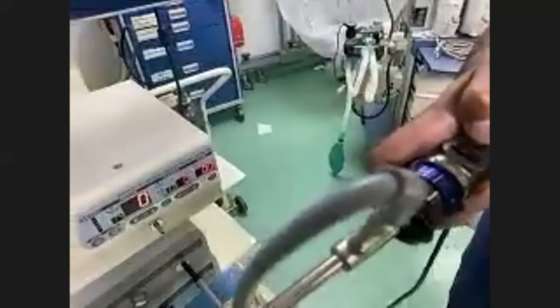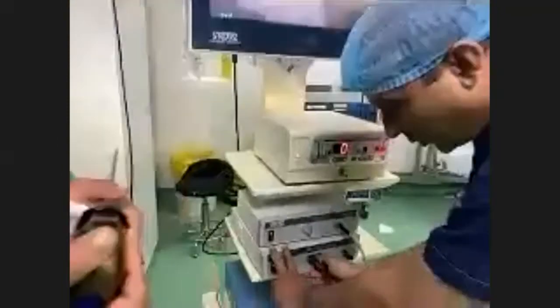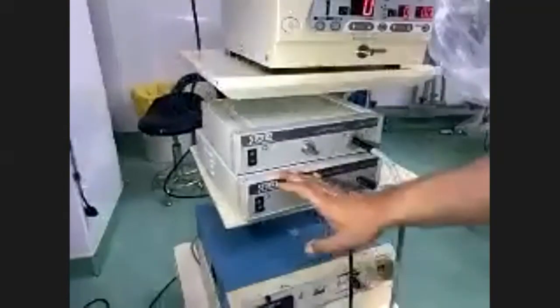Like this, okay? So before you start with your procedures, you should first of all do a white balance. Here, if you can show them the buttons over here. You press this button once, okay? And then with this button, upside and downside, you show the monitor. You press it to the white balance, and you just push it once and it says white balance is okay, right? So you may proceed with your procedure. Okay, hold it like this. This is basically a knob which you push in to start with the scope, okay?